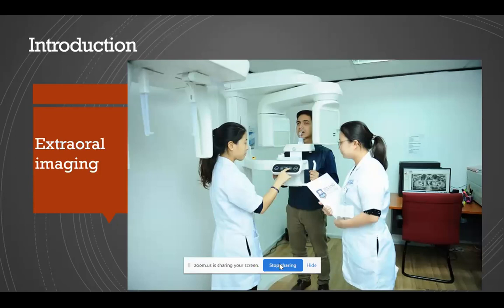Panoramic radiography is an extraoral imaging modality. That means the imaging source and the imaging receptor, that means where you capture the image, are all outside the mouth. So here you can see that the person is standing inside the confines of the machine, and there is someone who is trying to adjust the parameters in the machine. The important things that you need to understand in a panoramic machine are the X-ray source. You have a digital sensor on the opposite side, and both the source and the digital sensor rotate around the patient's head at the same speed in the same direction.